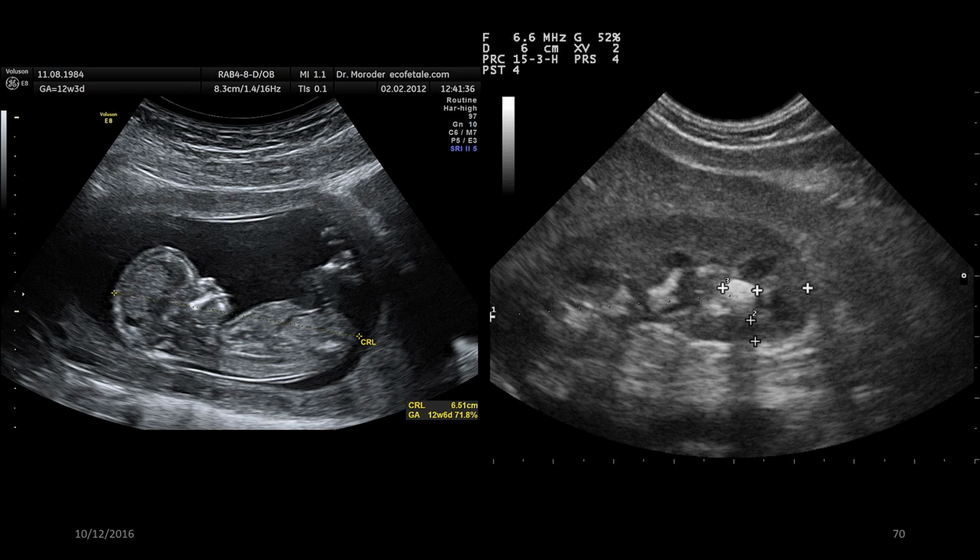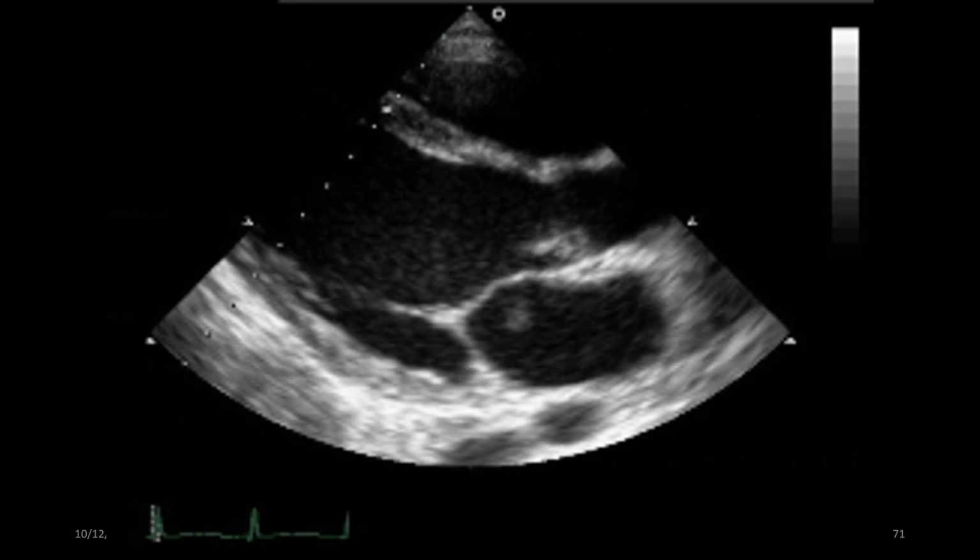Now, ultrasound also has some other purposes. We can view moving images, and the next picture is moving. So we have M mode, which is moving mode, and I can't remember what B mode is, to be honest. I don't do ultrasound. We also have Doppler ultrasounds, and I'm going to show you a picture of a moving ultrasound image of the heart, which is called echocardiography.